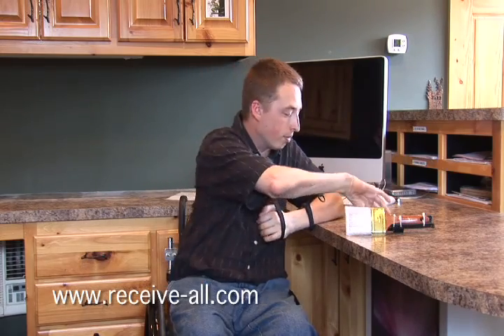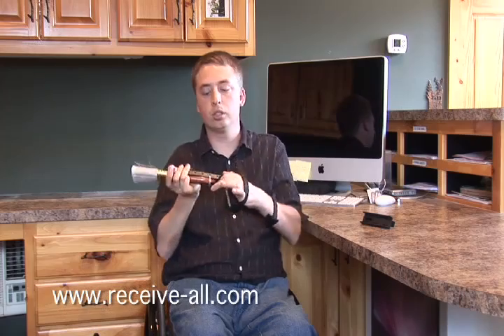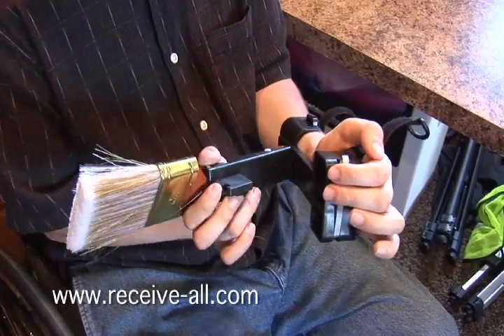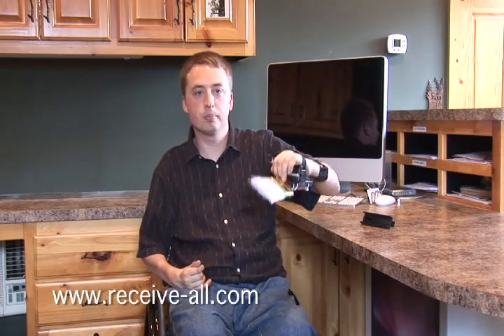So that attaches to your hand and forearm, and then you have these adapters. This is just a plain adapter. Here's one attached to a paintbrush. So whatever item you wish to use, the adapter is attached to it. Then it's ready to go when you want to use it. It just hooks in the rear of the arm brace, and there's this lever that locks it in place. And now I can use that item.